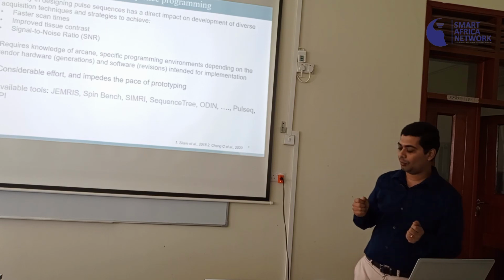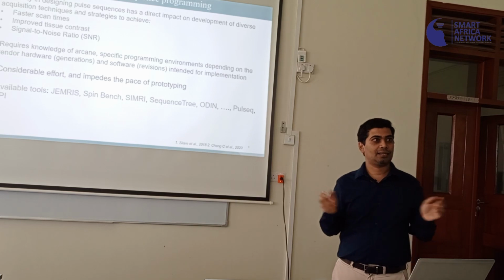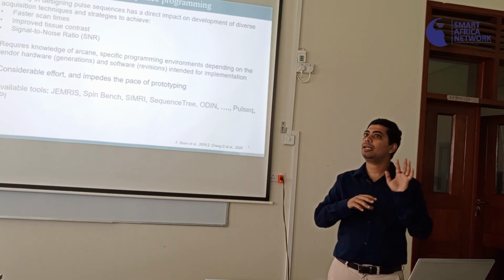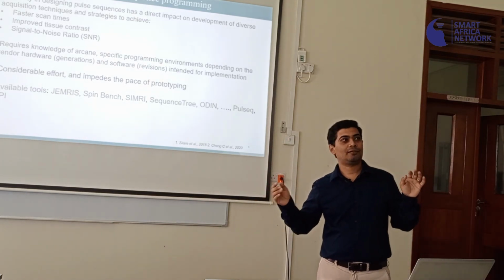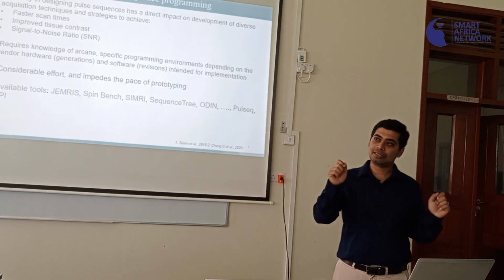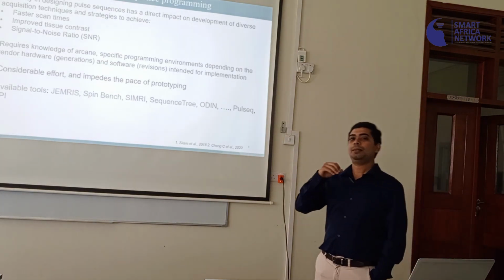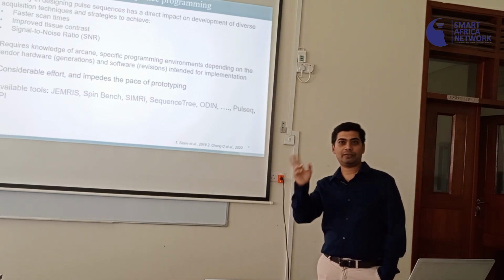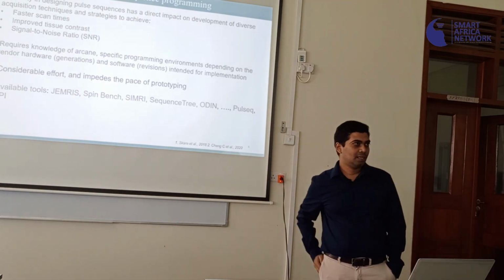But then it's a very carefully choreographed dance, and the dance happens via the laptop. And you basically tell which magnetic field is to get produced. For that, you move these pulses. And this whole choreography of playing pulses on one of the 3 coils, usually 2 out of the 3 coils, is called pulse sequence programming.